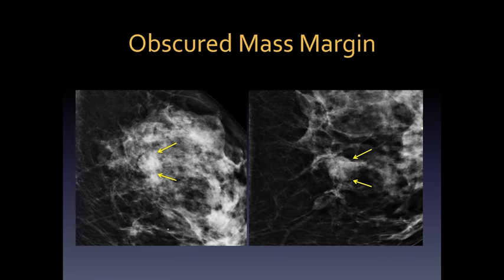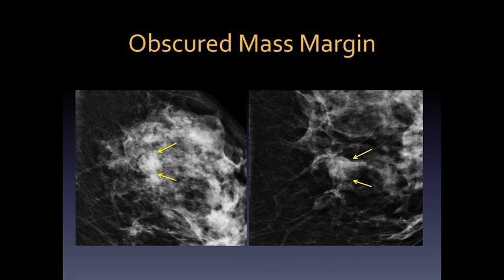Here is an example of an obscured mass. We see about maybe 50% of the margin being very clearly defined, but then when we get to the lateral or more anterior portion, it's really indistinct — so we call this an obscured margin. On two views, about 75% of the margin is circumscribed, but maybe 30% is really obscured. This dictates our management: we need to do ultrasound and further investigation.